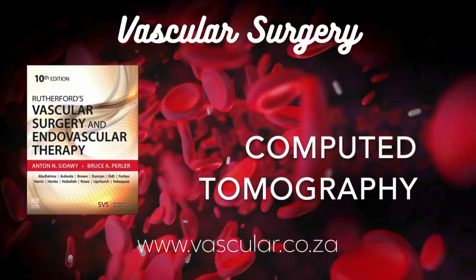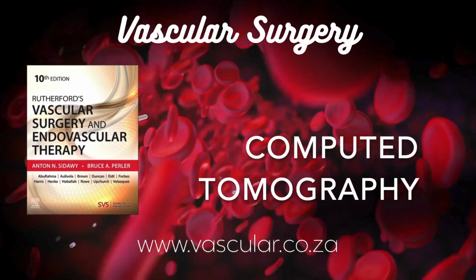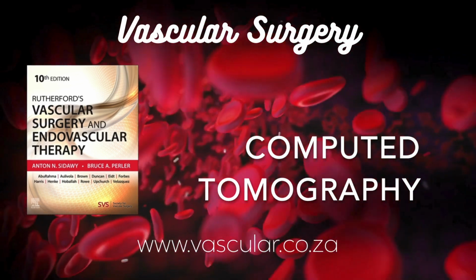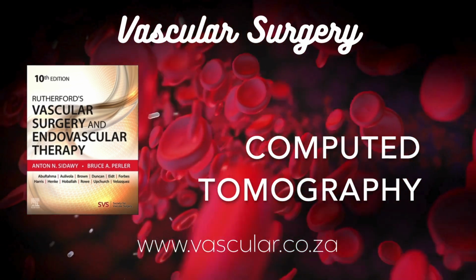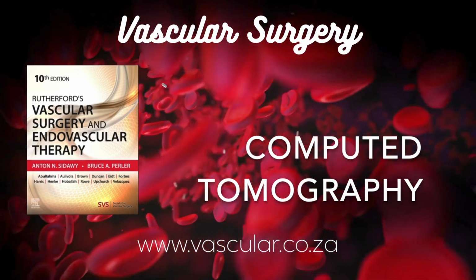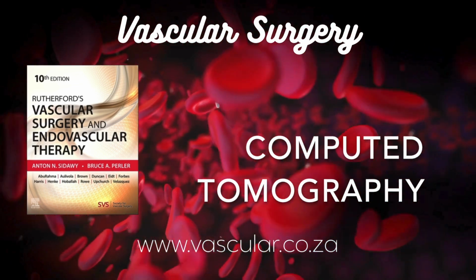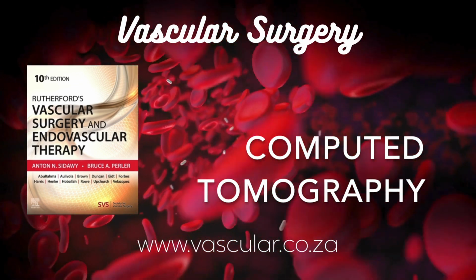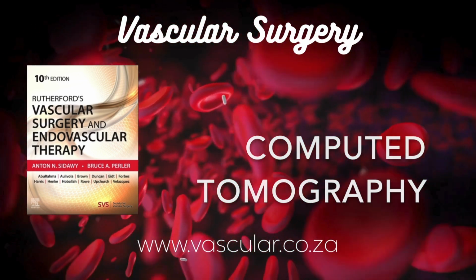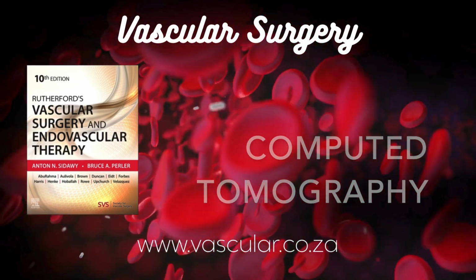Cool. What's the scale like? What are the numbers? It's a standardized scale. Air is defined as having a very low density, so it's way down at -1,000 HU. Okay. Water is the reference point, set at 0 HU. 0 for water. Got it. Fat is less dense than water, so it's in the negative range, maybe -20 to -100 HU, roughly. Soft tissues, like muscle and blood too, are a bit denser than water, usually around +40 to +60 HU. And then really dense stuff like cortical bone is way up at the top end, could be +1,000 HU or even higher. So quite a wide range.